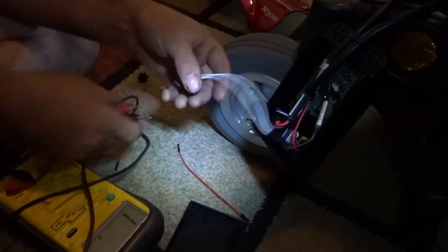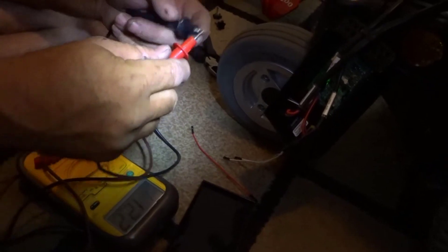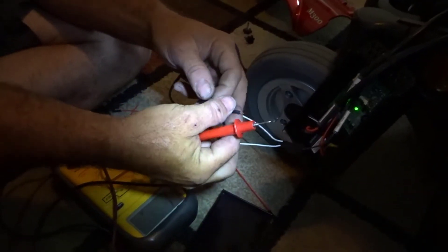It's a male connector going into a female connector — male and female go together. There's the continuity meter. That helps you guys out with mechanical things.